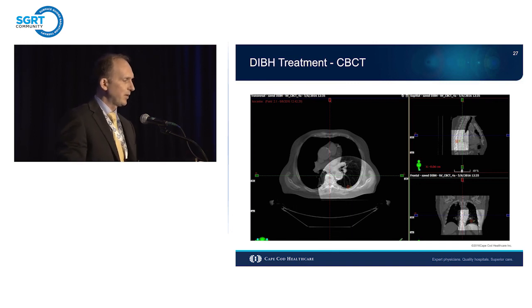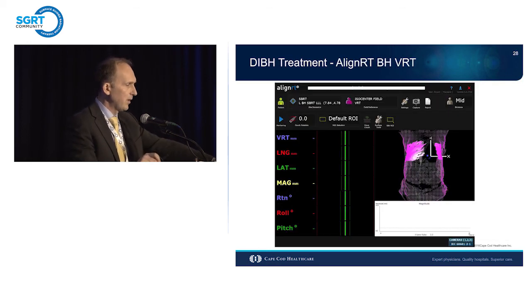I prefer this method. I keep teaching the therapists that when you see the deltas jumping, have one of your eyes on the imaging system on the gantry. Where those things are, how many things we are blocking. Is it reasonable? Is the patient moving? Let's look at the closed circuit TV. And that's a good reason to have two therapists, the physicist and the physician, right at the console when we are performing these procedures. Not to mention the 10 gray or 12 gray dose.